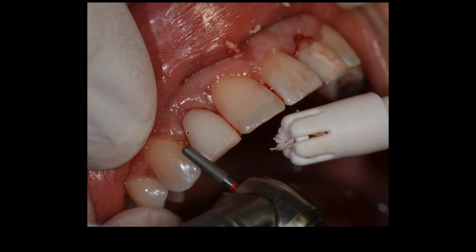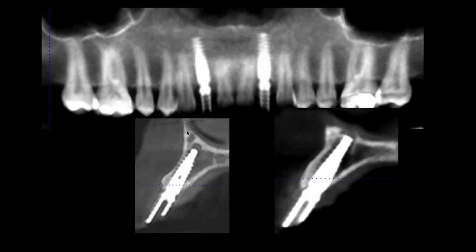So it goes in, and then my referral was there, and he just took his high speed and lopped it off and squared it up so that it was in the right position. So you can see him, a little action shot there, trimming the provisional. And here it is, screwed in place, and they're about where they want to be. They're right in the right spot.